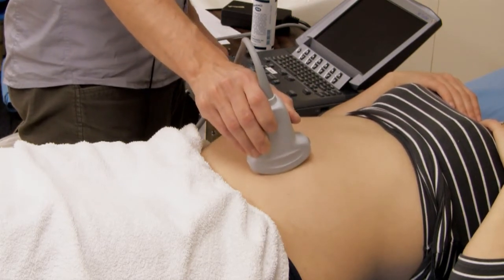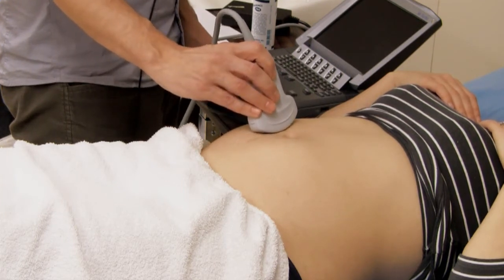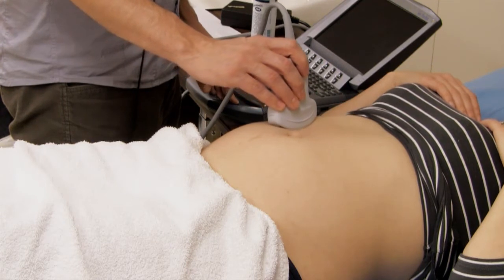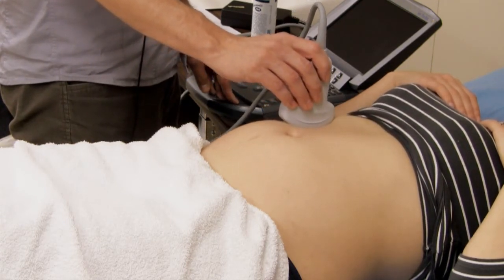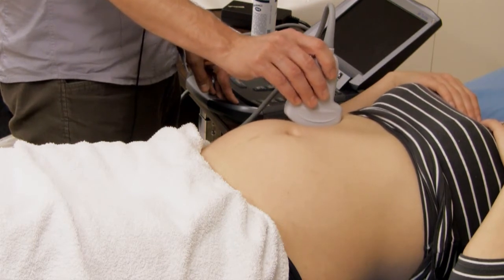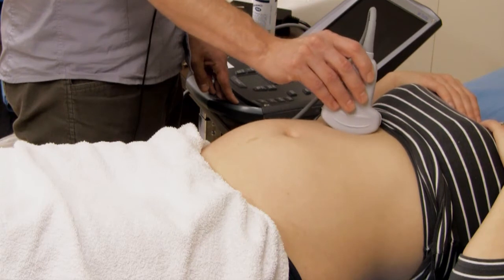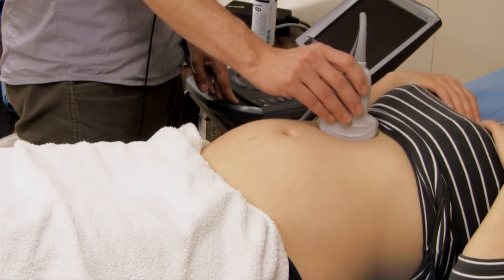to find it. Once you locate the spine, slowly slide the probe along the fetal spine in a longitudinal orientation. You may need to adjust the angle of the probe off of a purely longitudinal orientation to follow the spine. Once you have reached the end of the spine, perform a sweep to ensure that there is no other fetal structure in the area that resembles a fetal head.